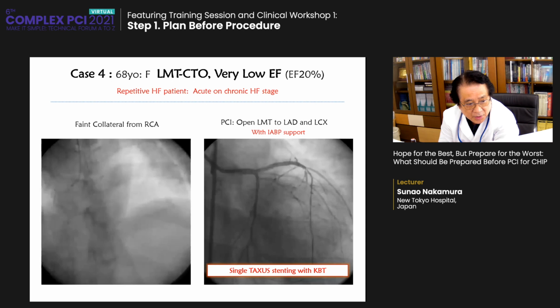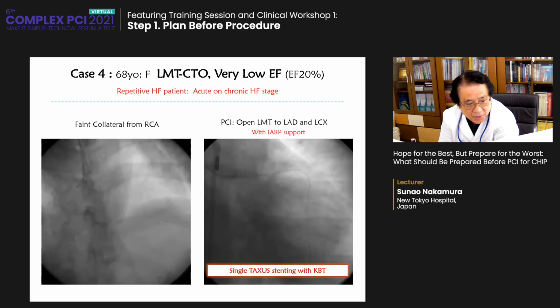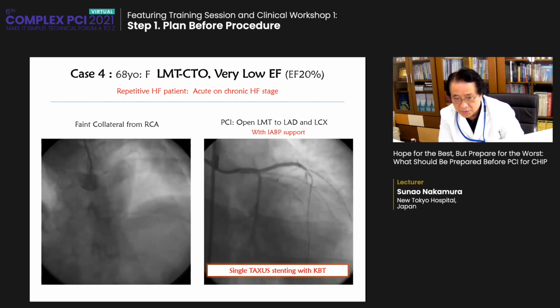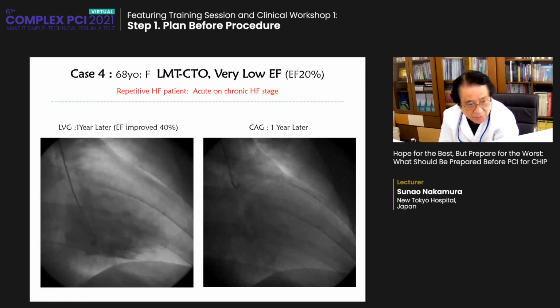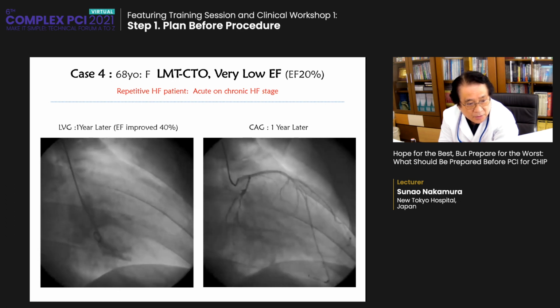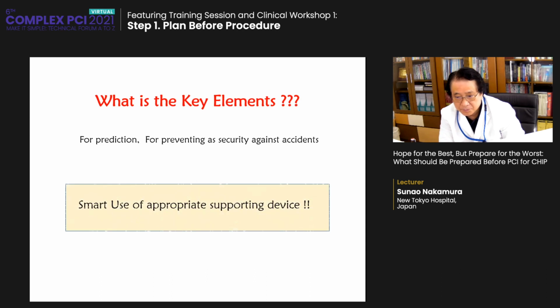I opened up the CTO with IABP support, guidewire passed, and a stent in the left main, KBT, within 30 minutes. This is a very quick procedure. Surprisingly, she recovered the left ventricular ejection fraction to 40% after 1 year. Just want to say, quickness is very important.